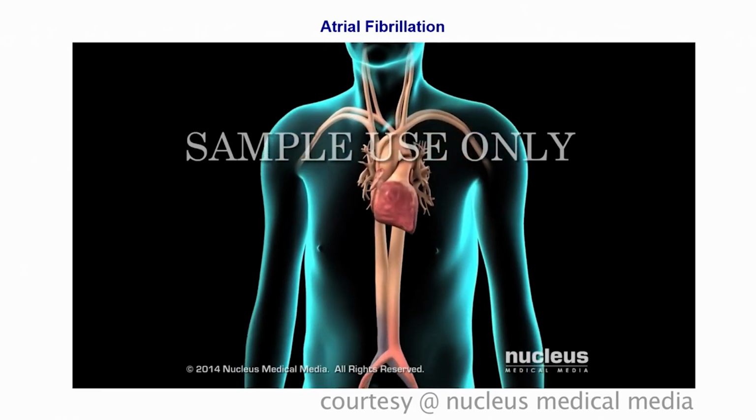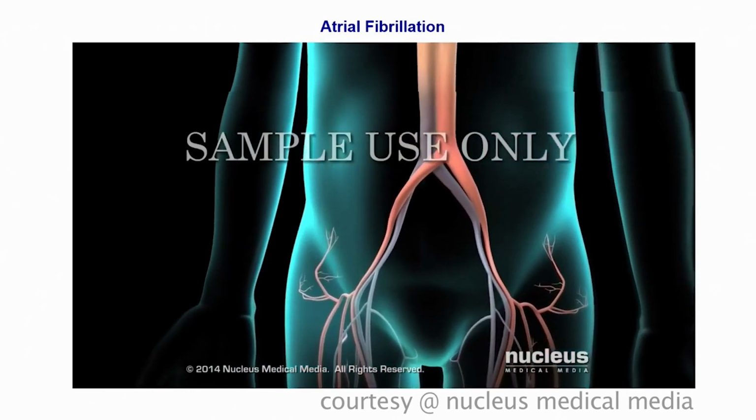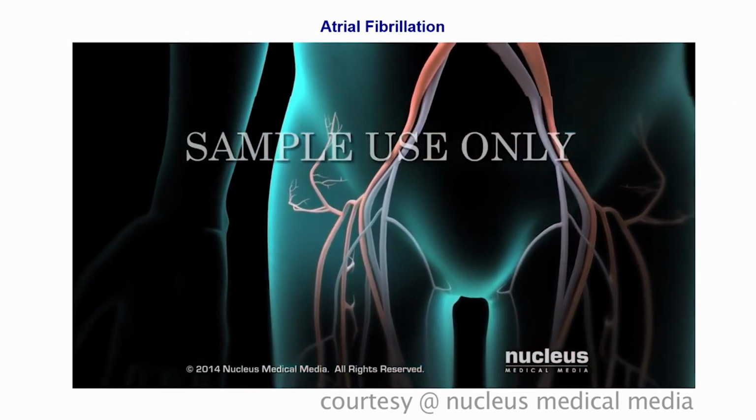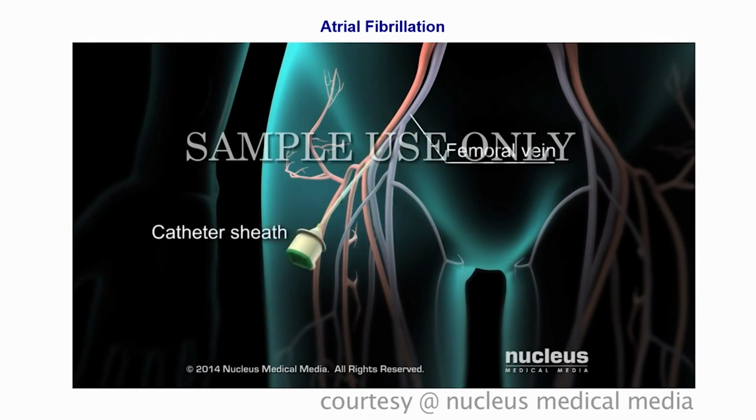For certain types of arrhythmias, a catheter ablation procedure may be necessary to stop the heart tissue from causing the arrhythmia. After numbing a small area in the groin with a needle, the doctor will insert a short hollow tube called a catheter sheath into the femoral vein.